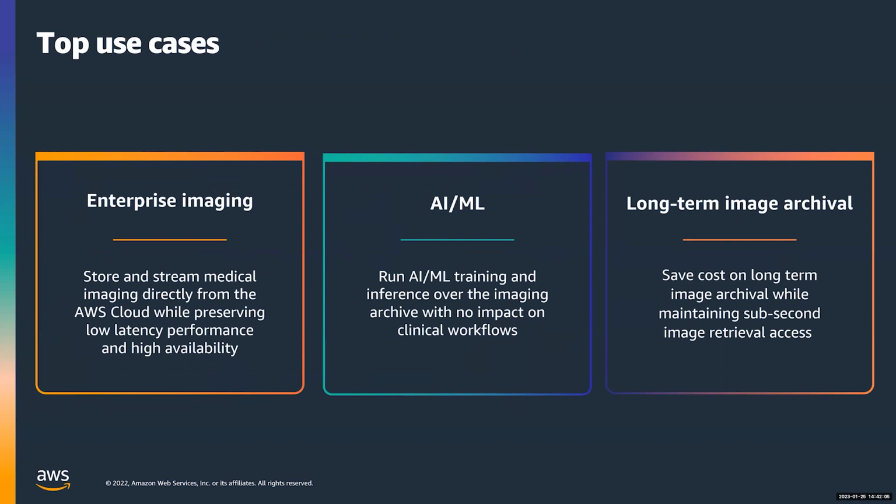So just like you could have different tiers in S3 where the data trickles down the different tiers to be less expensive to sustain, or let's say to keep as it gets older, HealthLake Imaging will have the same concept where data which has been stored for a while in HealthLake Imaging will actually be less costly than the more recent data.